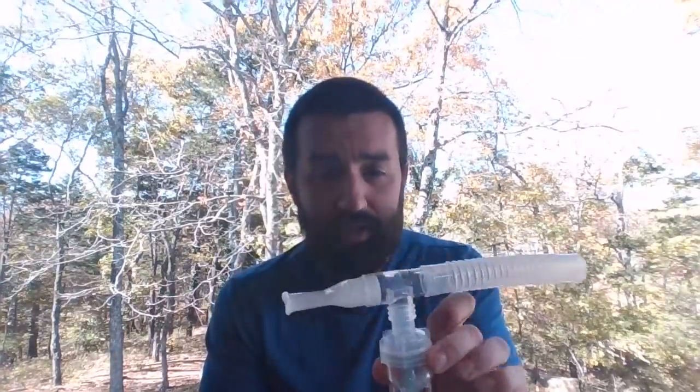But once again, they don't have to be overly involved. They don't have to be breathing as fast as they possibly can and deep or anything. We don't want them hyperventilating and causing problems. So that is our setup for this.